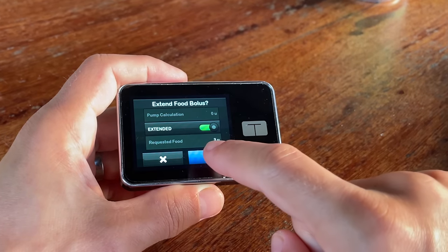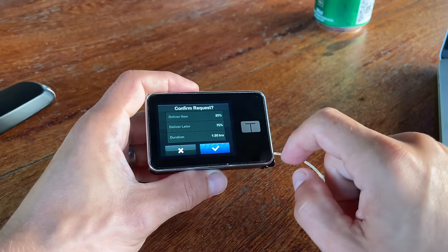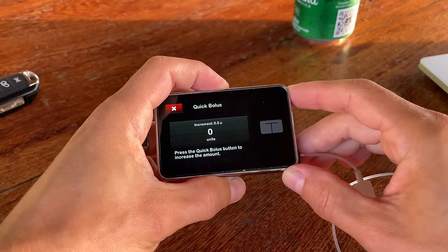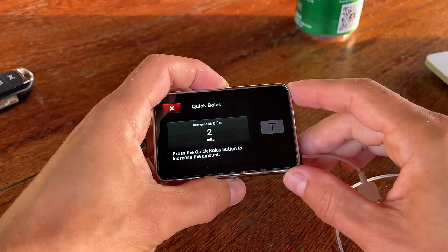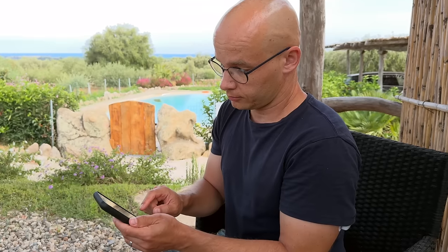One thing I love about T-Slim X2 is the extended bolus feature — I can tell the pump what percentage of the bolus to deliver right away and what percentage to deliver later over a defined period, even while in auto mode. If you've ever eaten pizza you know what this is good for. Omnipod 5 doesn't have the extended bolus in auto mode — it's only available in manual mode. They say the Smart Adjust algorithm is smart enough to handle slowly absorbed meals, but I'd definitely like more control over this. T-Slim X2 also has a quick bolus you can initiate without looking at any screen using the top button while the pump stays in your pocket. With Omnipod 5 you always have to look at the controller screen when giving a bolus, but this isn't a big deal for me.